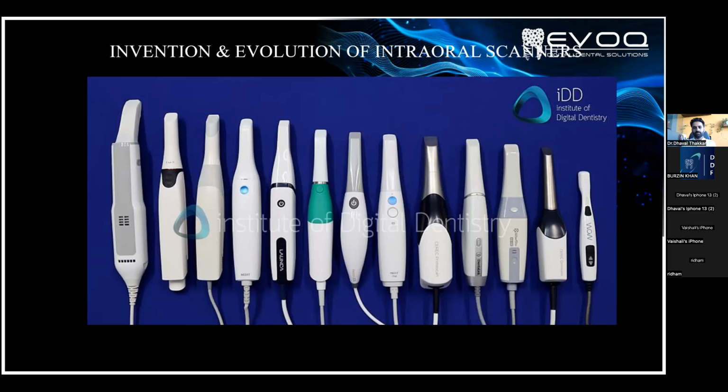The second thing is the scanning speed. Practically speaking, at the clinical level, we cannot measure the scanning speed in a particular patient because we are never going to scan the same patient with two different scanners with the same patient compliance. So ultimately, scanning speed depends more on the operator's skill as well as the patient compliance.